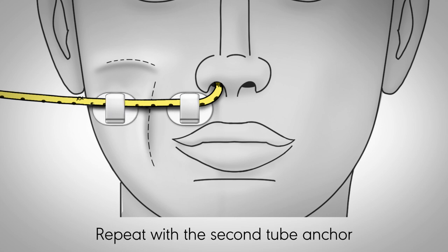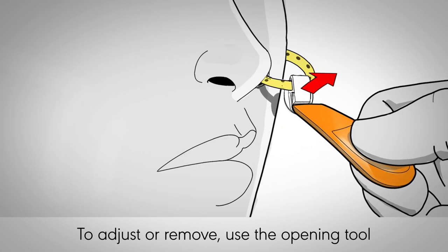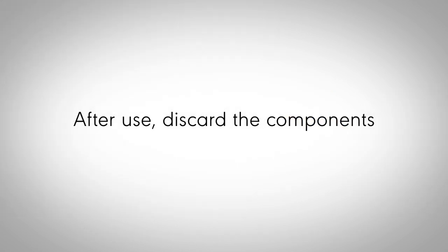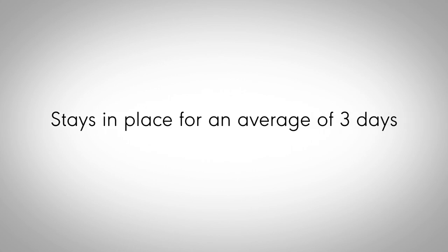Repeat with the second Anchorus tube anchor. To adjust the tube or remove the device, use the opening tool provided to open the clamp. After use, discard the components. The Anchorus device has been shown to stay in place for an average of three days.